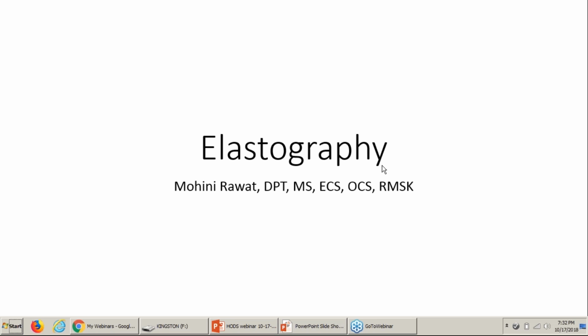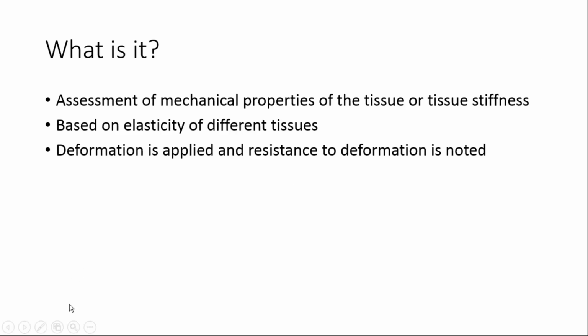I'm not sure if you are aware of this technique, which is relatively new. They're using it in other areas also other than MSK, like breast imaging and thyroid and liver imaging. And so elastography is essentially the study of mechanical properties of the tissue.